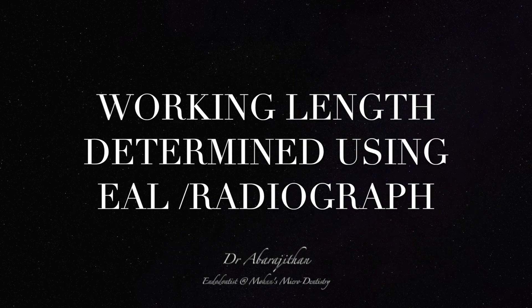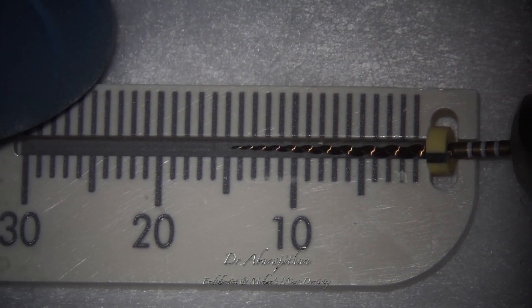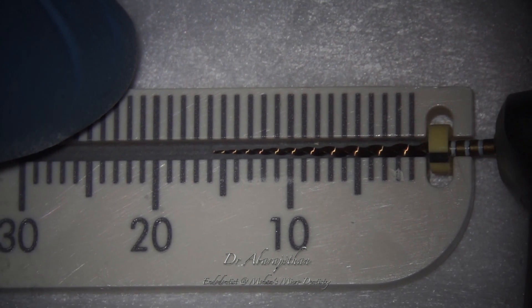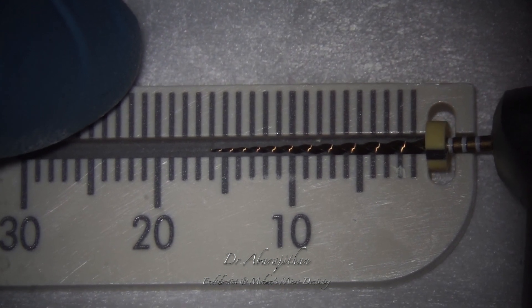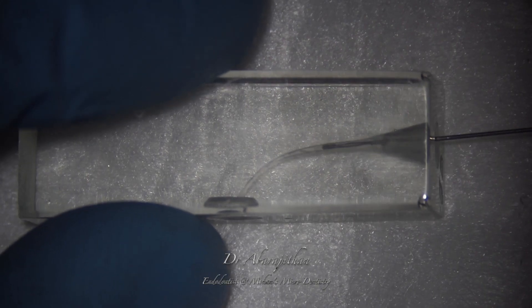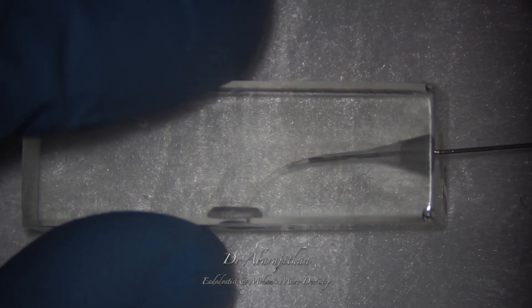At this stage, the working length will be determined either using an electronic apex locator or a radiographic method. This type of endodontic ruler will be very useful to adjust the working length without using the left hand. Now the canal is again filled passively with sodium hypochlorite.